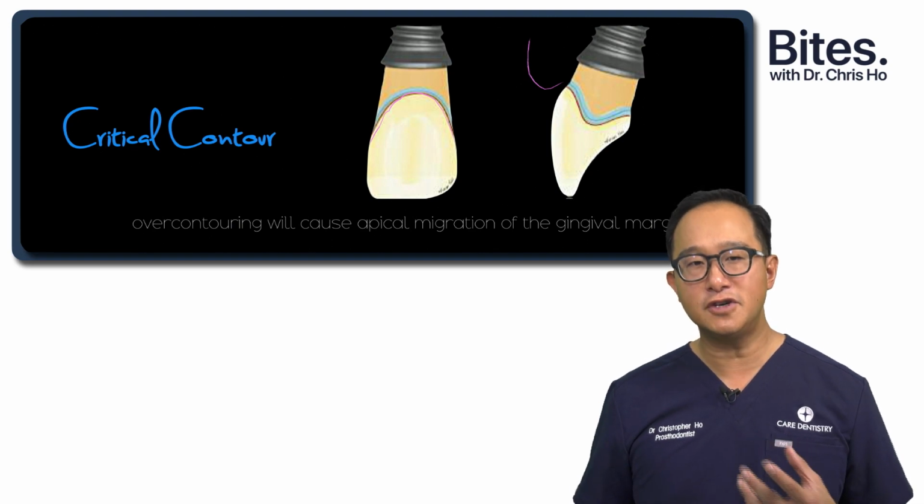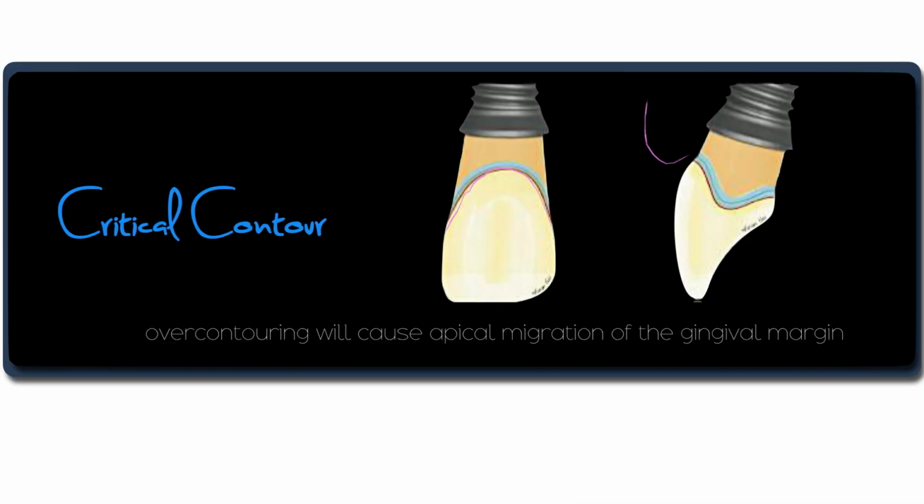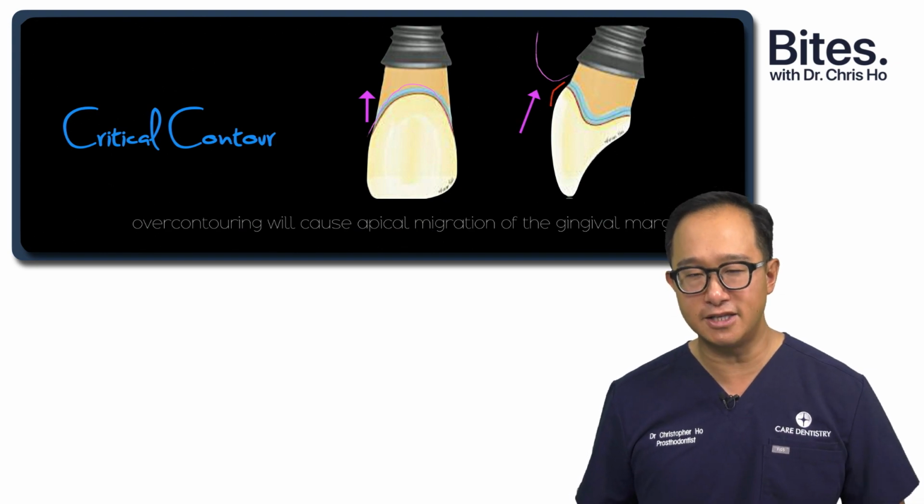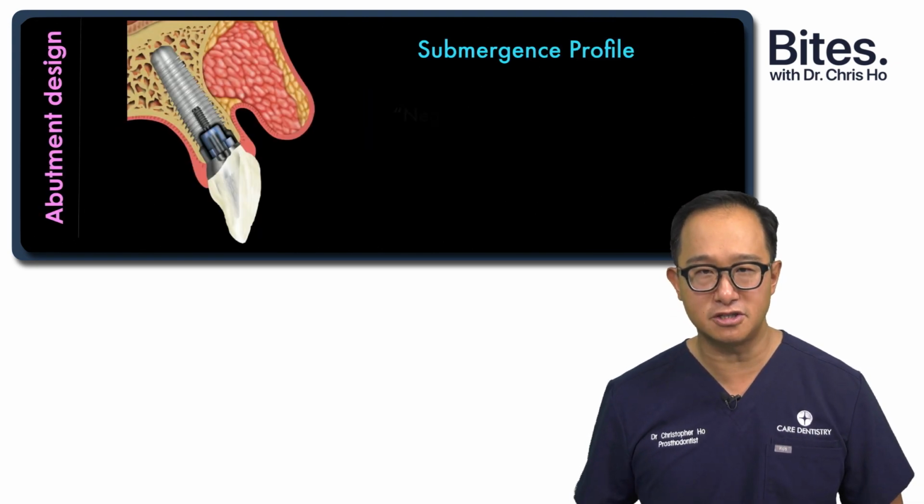So if you over contour the restoration, so here you can see when you over contour the restoration, you'll see that the soft tissue will often creep up. So you'll have some apical migration of the gingival margin. So you can actually cause some of the gingival recession around your implant by over contouring the restoration.